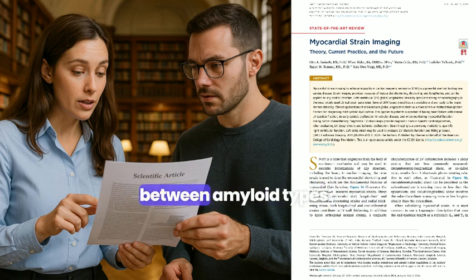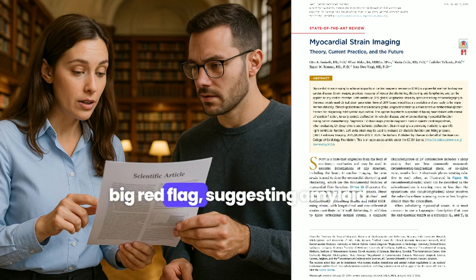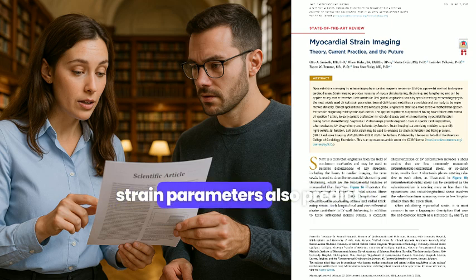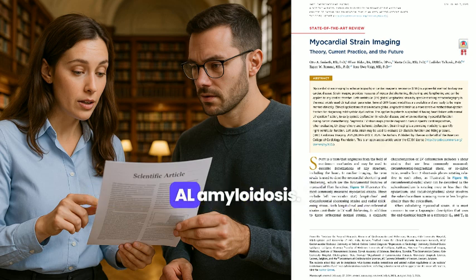Does the pattern differ between amyloid types? Not clearly, no. But the apical sparing, maybe combined with the EF-GLS ratio, is a big red flag suggesting amyloid. Strain parameters also predict outcomes and might help monitor treatment response in both TTR and AL amyloidosis.